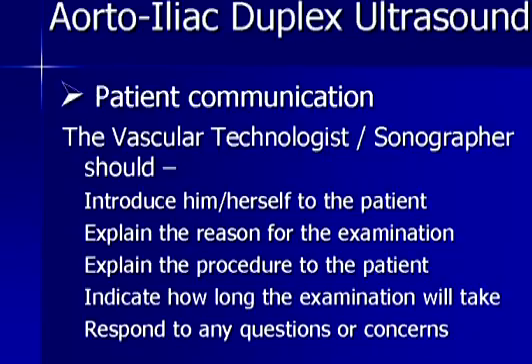And at the same time, explain a little bit about the non-invasive nature of the ultrasound examination and what the patient can expect. Indicate approximately how long the examination normally takes, and also tell them there may be exceptions. It may be shorter, it may be longer, but typically this examination will take 60 minutes, whatever it is your laboratory protocol standardizes upon. And we have found that the most important thing you can do in terms of patient satisfaction, and this is based on actual patient surveys, be certain that you respond to any patient concerns or questions as fully as possible.